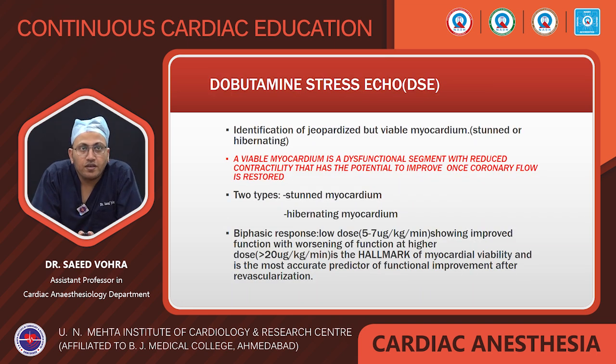Dobutamine stress echo is used to identify jeopardized but viable myocardium, which can be either stunned myocardium or hibernating myocardium. A viable myocardium is a dysfunctional segment with reduced contractility that has the potential to improve once the coronary flow is restored. It is of two types, stunned myocardium and hibernating myocardium.